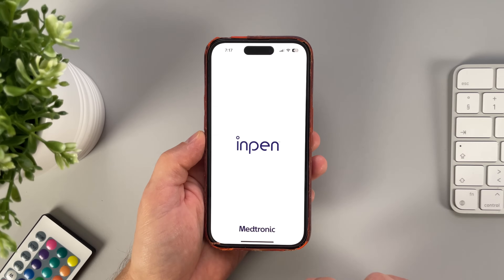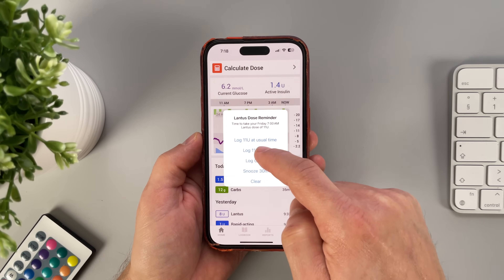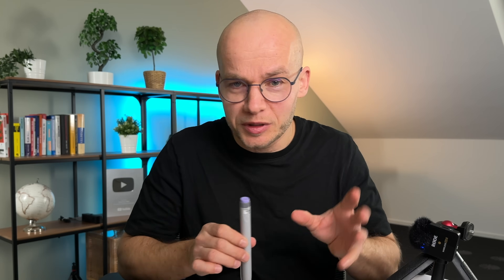When I get the reminder, the app also asks me how much long-lasting insulin I'm taking and at what time, so it can log everything for me. Logging of long-lasting insulin is manual, but I really like the reminders and the option to track it.